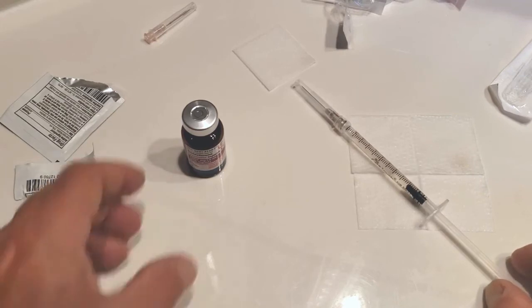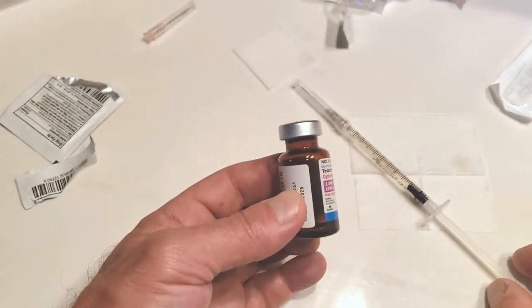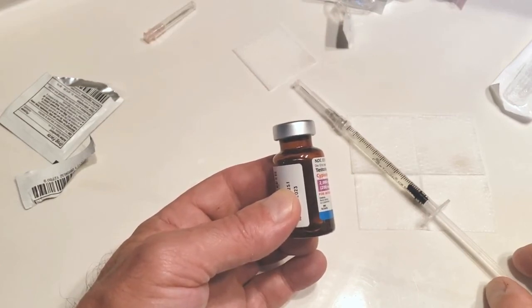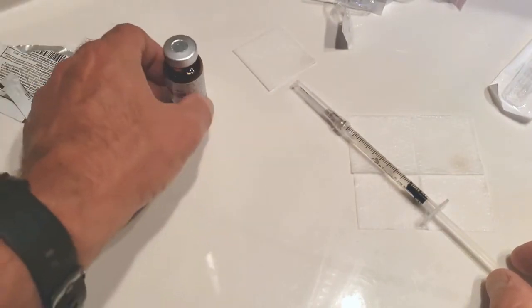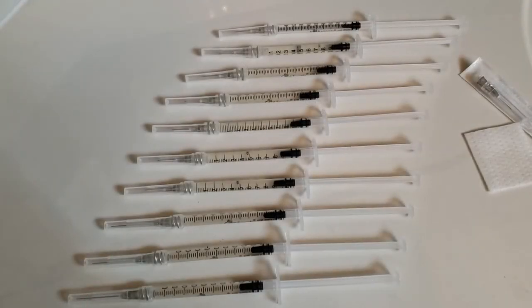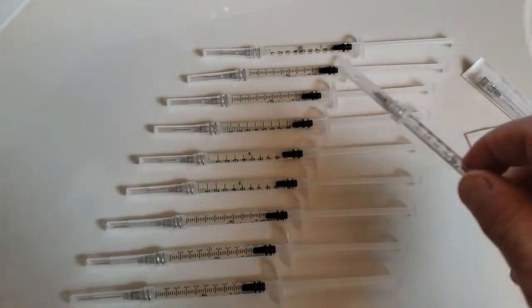You can go ahead and finish preparing syringes from the whole bottle. Depending on your dose, you'll have between 10 and 13 syringes pre-filled. You can store these in a dark, climate-controlled drawer. The finished product: the entire contents of the vial have been drawn into the syringes and capped with a sterile 27-gauge needle. Store them in a dry, climate-controlled drawer such as your bathroom drawer.